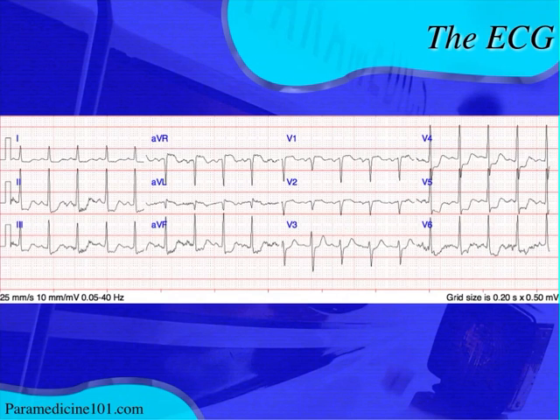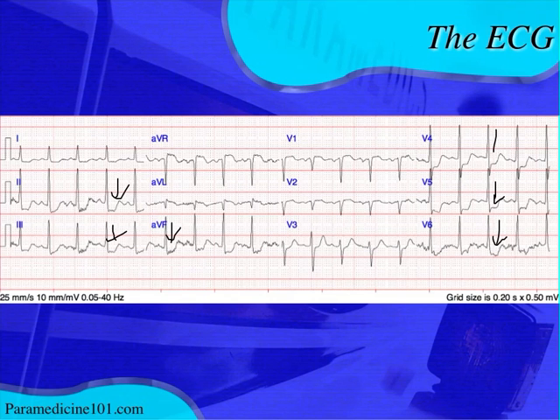And do we see ST changes? Let's take a look at this — and you certainly do. I think everybody would notice that you see ST depression in almost every lead: lead two, lead three, AVF, over here on the low lateral leads V6, V5, V4, maybe a little bit in V3. V2 is kind of flat, and then V1 looks maybe a little bit elevated. AVR looks elevated, and AVL maybe looks a little bit elevated as well. Lead one looks depressed.